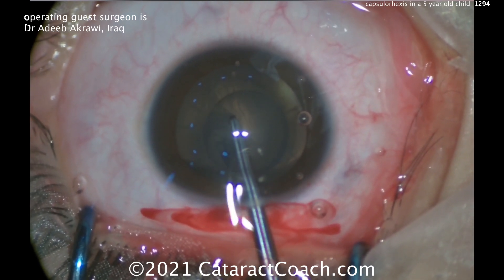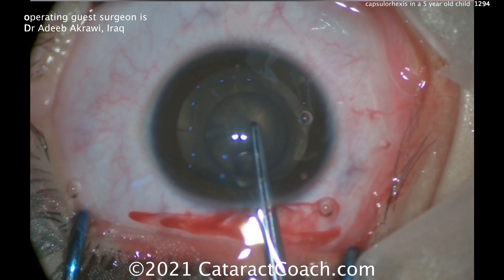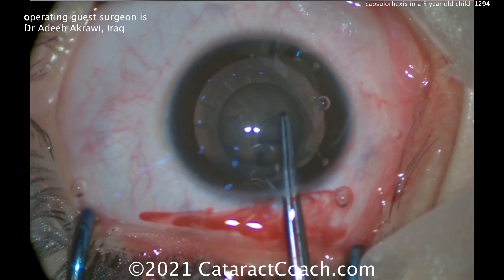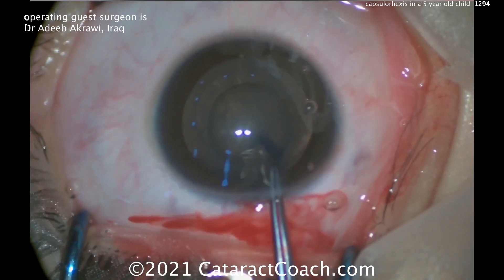I like the technique that he used here — a lot of control. The take-home message here is that the rexis is very difficult to perform in these young patients and it wants to run away from you, because the capsule is so elastic.